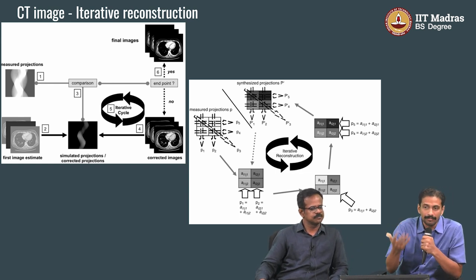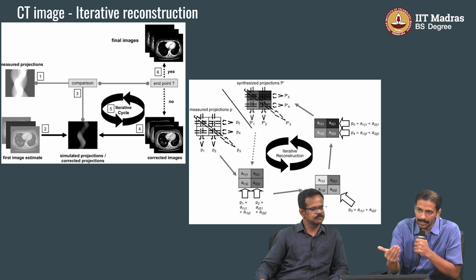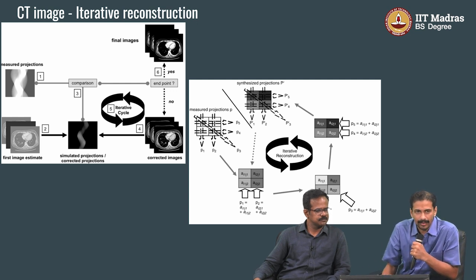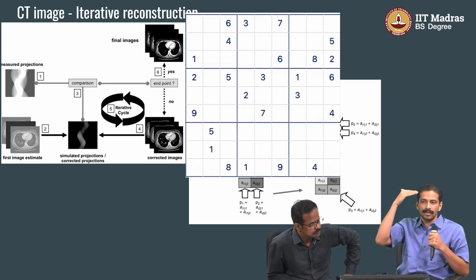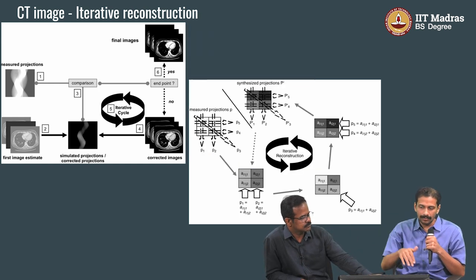So what is the benefit of it? You get good quality images without giving much radiation to the patient, which is a very big benefit of reconstruction if it is done with deep learning algorithms. So this is one area where AI people are working heavily. You understood, right? Raw data is collected by going round and round, and the reconstruction is nothing but the sections. We'll show those sections and how we scroll.